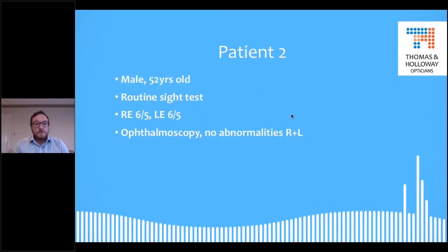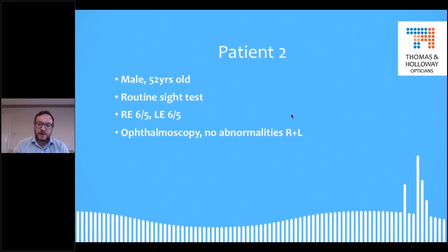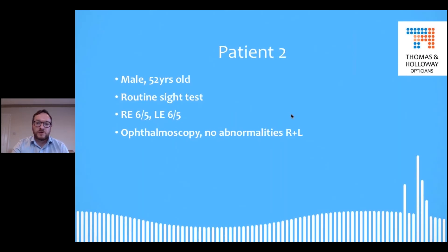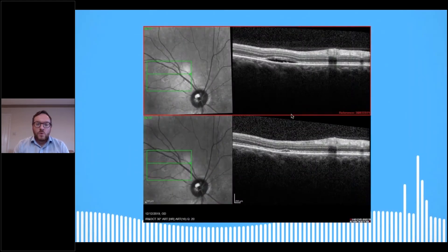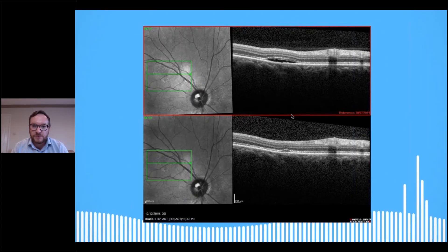Patient two: male, 52 years old, routine sight test. Vision 6/5 right and left, ophthalmoscopy — no real abnormalities right and left. When we look at this, these are the same eye separated by time — the top image was taken July 2019, the bottom image December 2019.